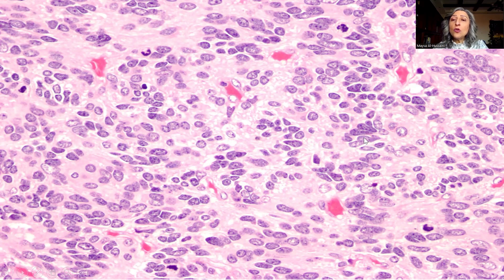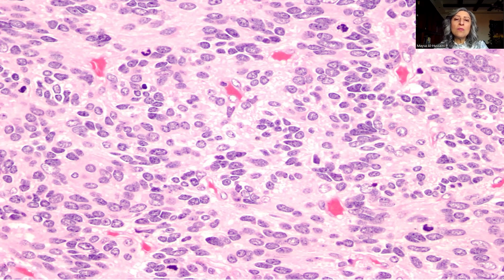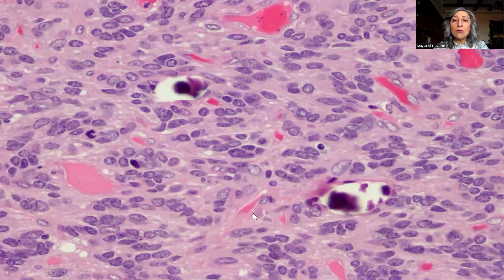The tumor cells are more or less monomorphic, with oval to round nuclei and fine chromatin, giving an appearance that might resemble embryonal tumors. There is also some fibrillarity in the background.